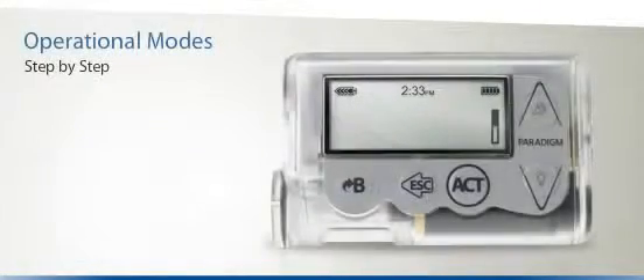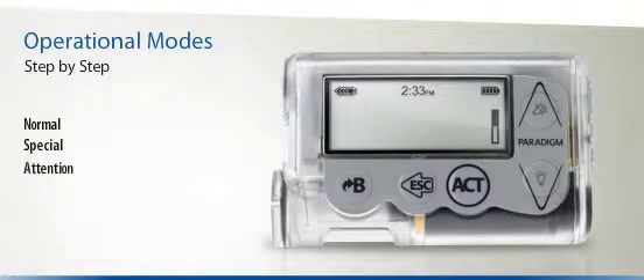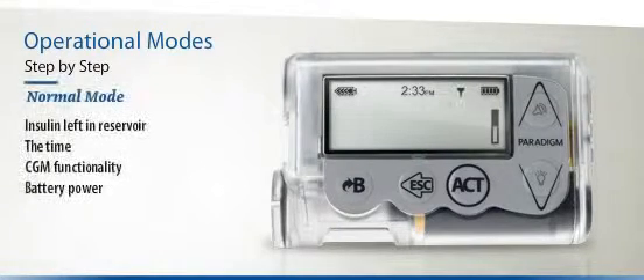Your Paradigm Veo has three basic operational modes: normal, special, and attention. On the top left side of the screen you will see how much insulin is left in the reservoir. In the centre of the screen you will see the time. If you're using continuous glucose monitoring, you will also see a symbol that looks like an antenna. Finally, you will see how much battery power is remaining.